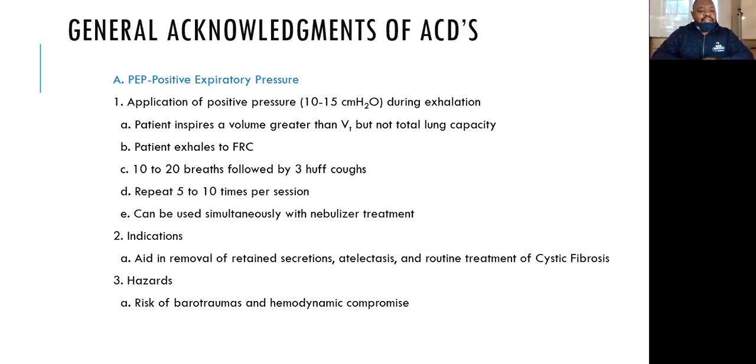Indications: to aid in removal of retained secretions, atelectasis, and routine treatment of cystic fibrosis patients, right? We want to use it to aid in the removal of those blocked up secretions, or if they have a lot of atelectasis. Some patients use this for atelectasis. They take a deep breath in, blow into it, and that back pressure can help pop open some of those closed alveoli, right?